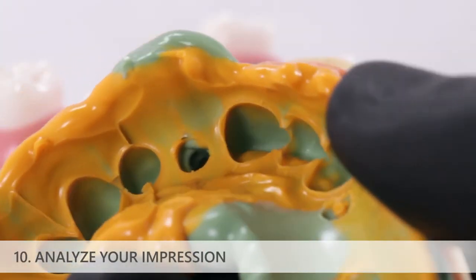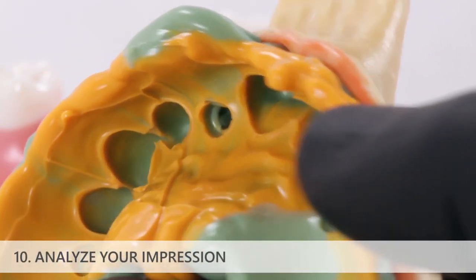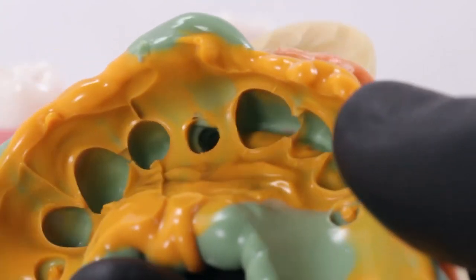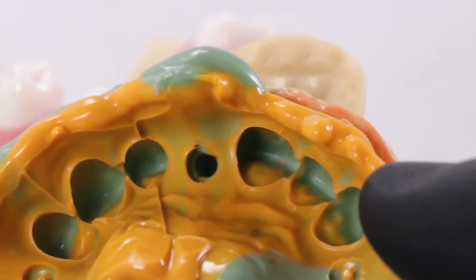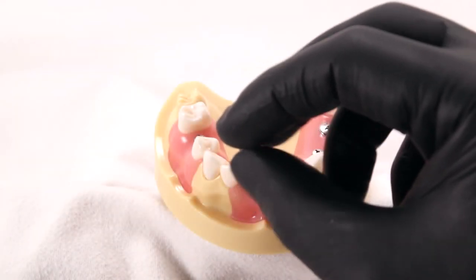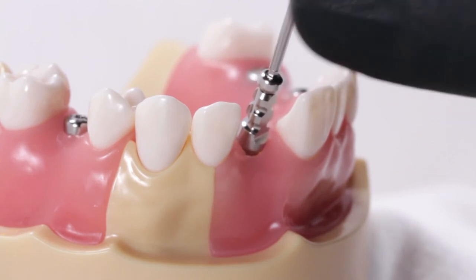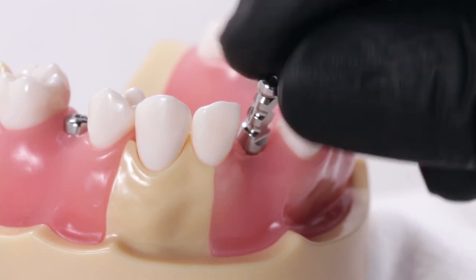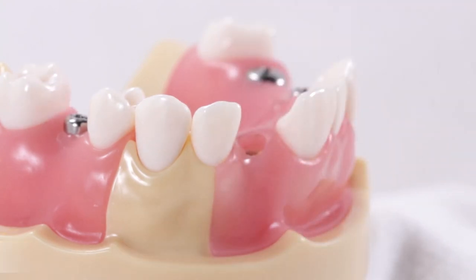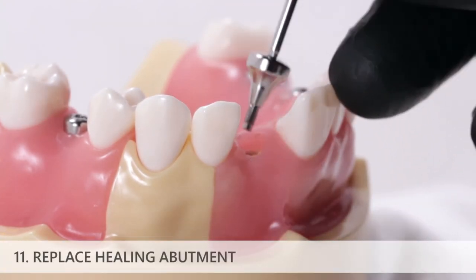Analyze your impression. Verify that there is adequate adaptation of impression material around the location of the impression coping and adequate detail of the surrounding teeth. Use a prosthetic driver to unscrew and remove the impression coping screw and then remove the impression coping. Replace the healing abutment immediately to prevent soft tissue collapse.